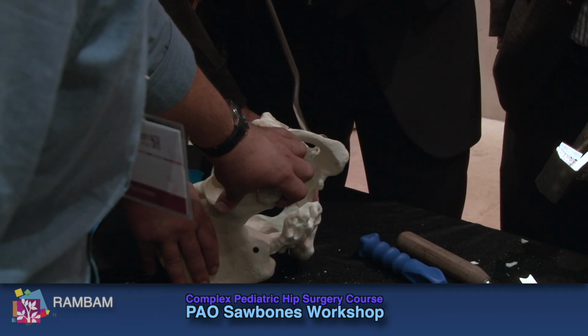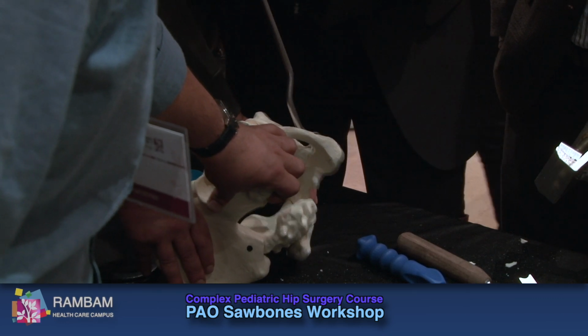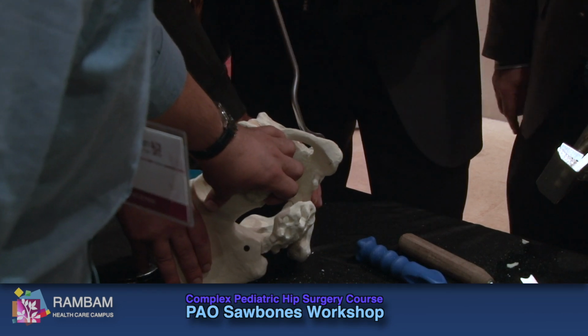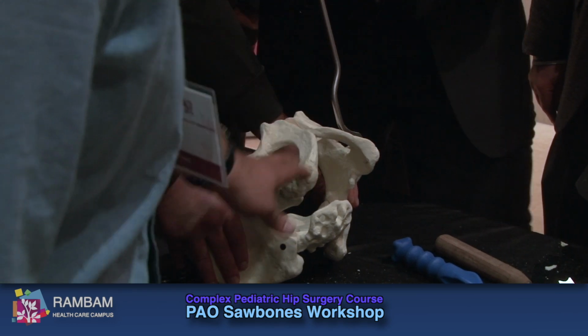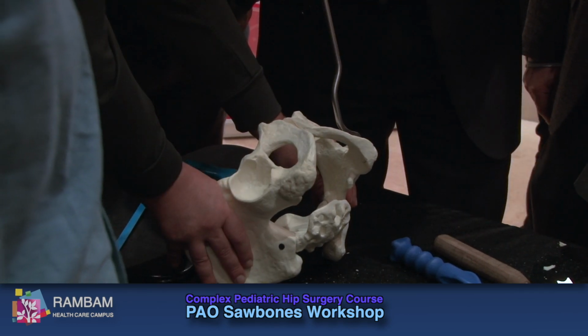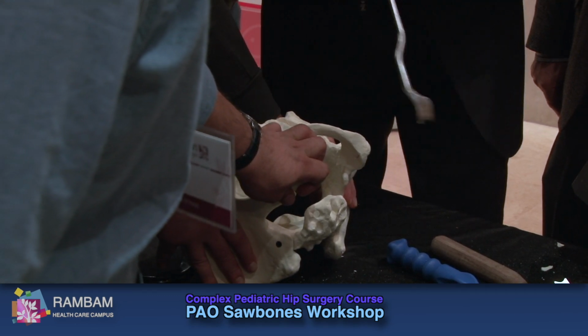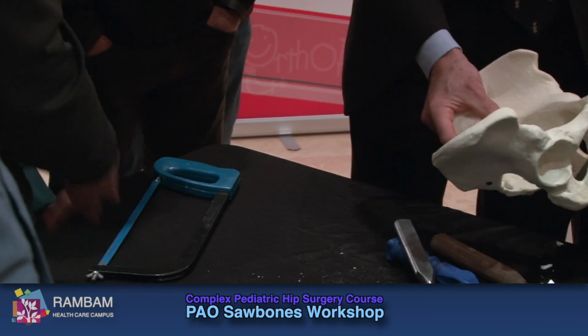Corner down here, because I know that's going to be really good. Just go slowly. The thing is, this is very hard bone, and because you're below the collar, you cannot crack into it. So I'll leave it like that just to get a sticking point. Now we can put this on here for a second.